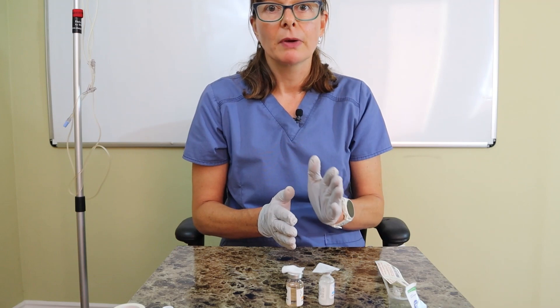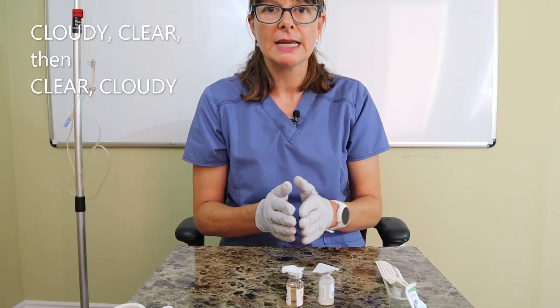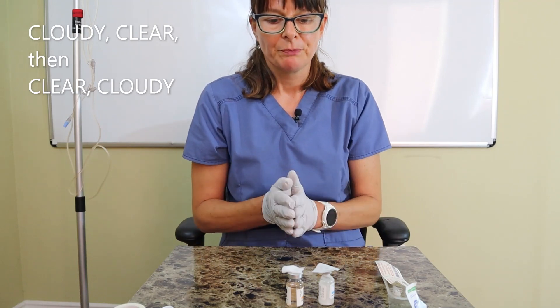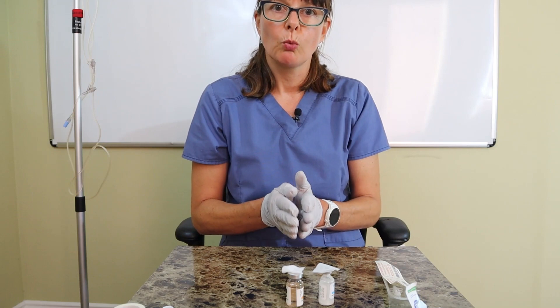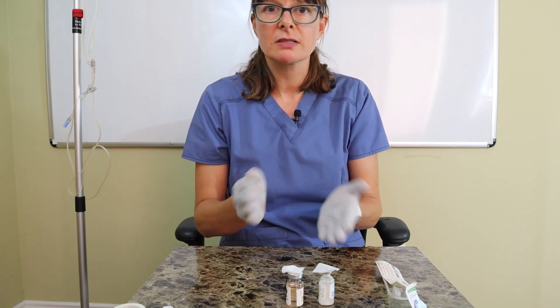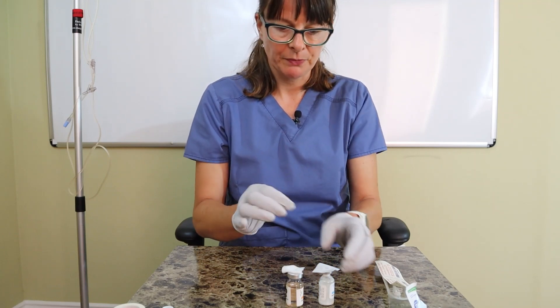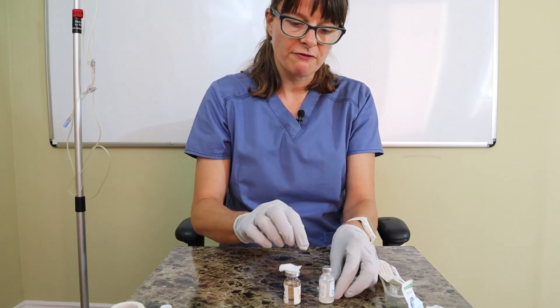There is a saying: cloudy, clear, clear, cloudy. Think of a nice bright day — it's cloudy in the morning, clears during the day, stays clear in the afternoon, and gets cloudy in the evening. There are other acronyms you can use, but the key point is: we clearly don't want any insulin mixed into the other vial. The worst-case scenario is getting the longer-acting insulin into the shorter-acting vial.